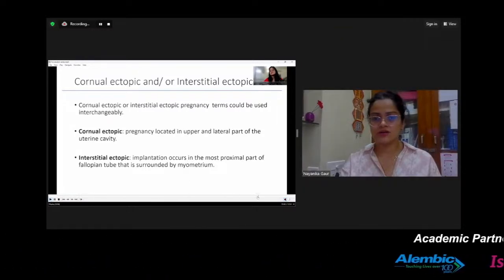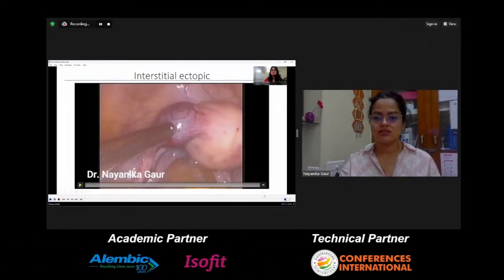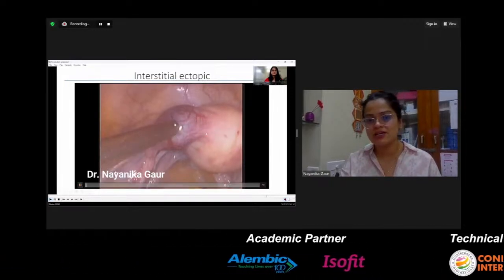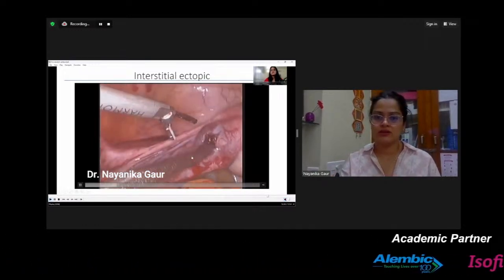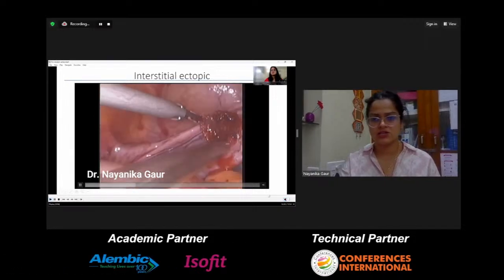So here I will be showing you the difference. In this case, you can see this was an interstitial ectopic pregnancy, because there was some redundant tissue towards the uterus left, and the maximum bulge was in the fallopian tube. Therefore, after the theoretical definition, we did categorize it as an interstitial ectopic pregnancy.